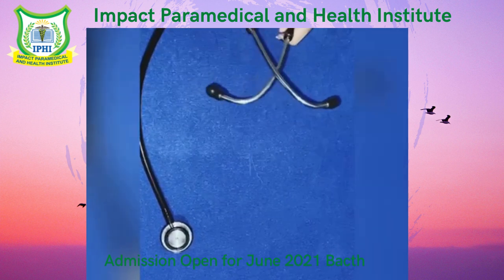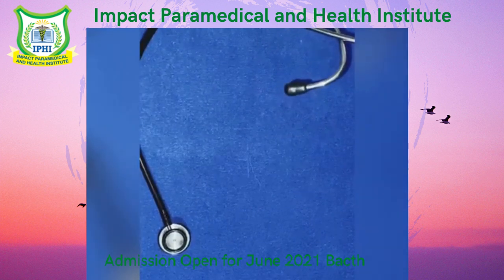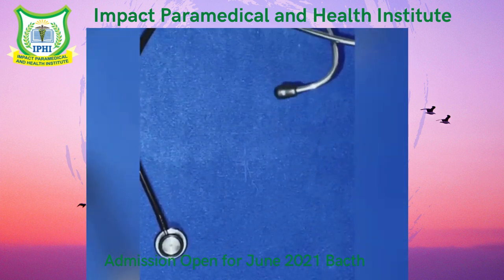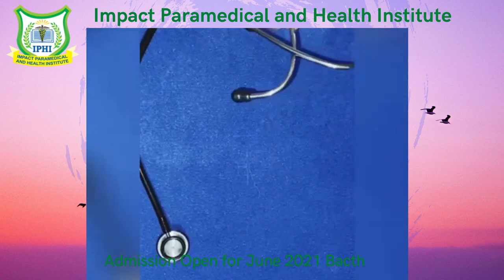Then this is the rubber tubing, or you can say it is the trunk part. It is used to listen to the body sound. It helps to prevent sound from the environment so that the doctor could analyze the abnormality.